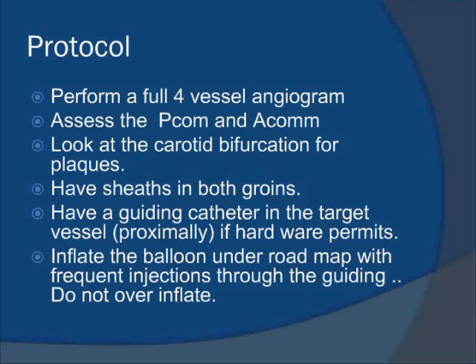to do this procedure. I prefer to have a guiding catheter in the target vessel and through which I take the balloon, because it allows me to inject into the common carotid and assess the external carotid artery along with the test occlusion. I prefer to inflate the balloon under roadmap with frequent injection through the guiding catheter, so I'm sure I do not overinflate and induce a dissection, because if the patient fails the test occlusion and we have a dissection, then we can have a major stroke.